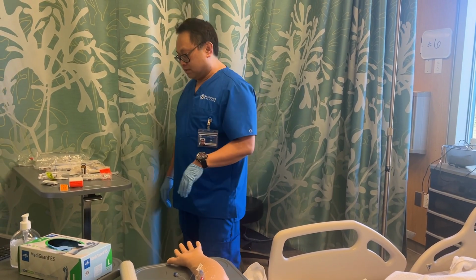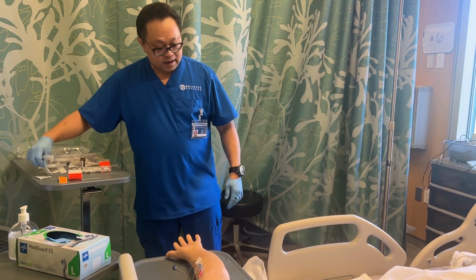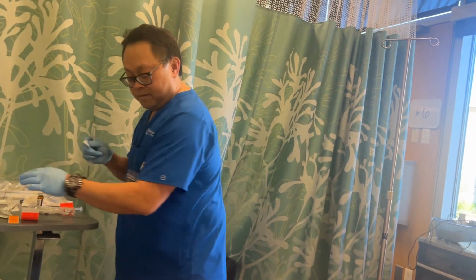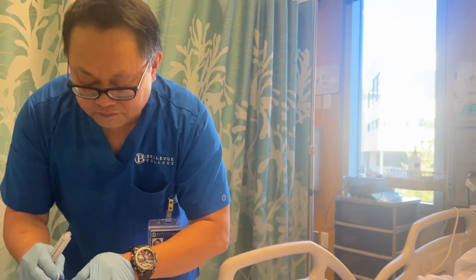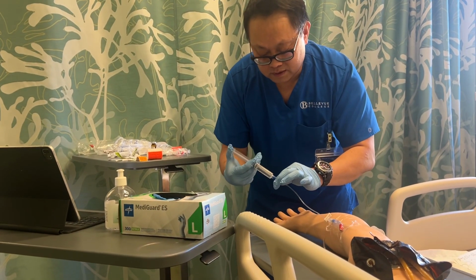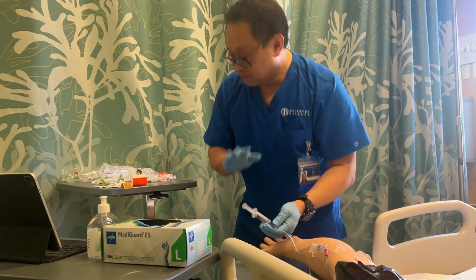Okay, it seems like it's good. So I'm going to flush my medication. Again, this was supposed to have a green cap on it, so we're going to pretend that there's a green cap on it. So I'm going to scrub the hub for 15 seconds, let it dry for 5, and I'm going to unlock this and flush it. Okay, now it's flushing, so it's patent.